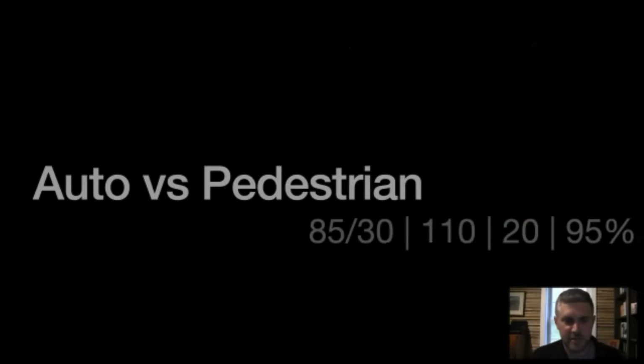Which brings us to our teaching point, right? Be careful to scrutinize the subphrenic space in the left upper quadrant, right? So that brings us to our third case, right? And this is another auto versus pedestrian. So some other poor person walking around the streets of Cleveland gets hit by another car.